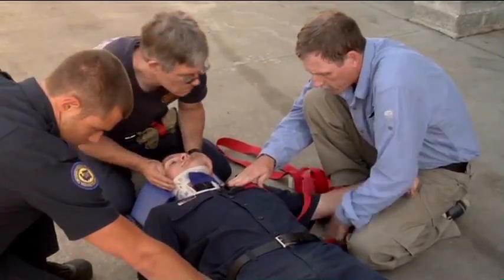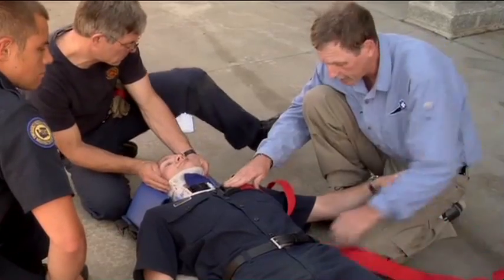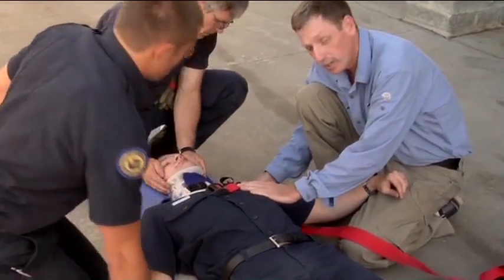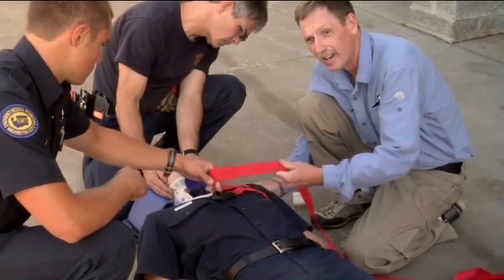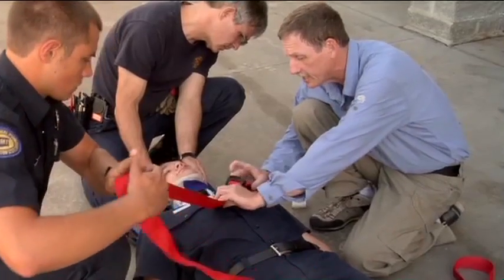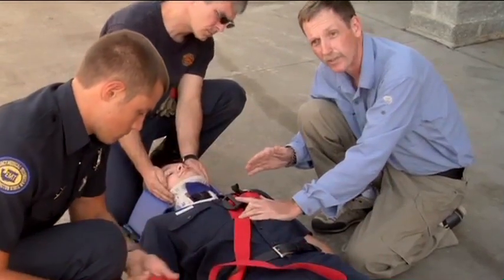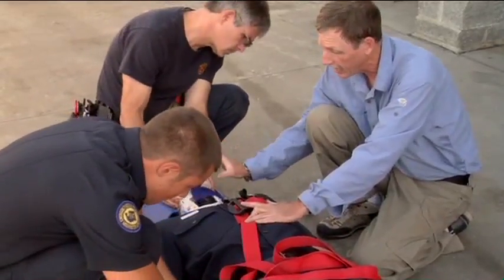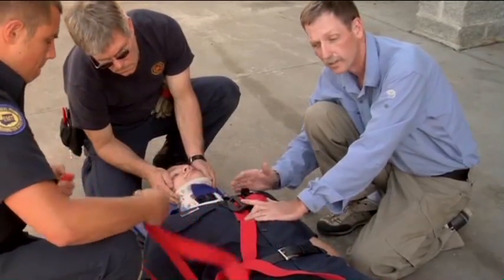Now I'm not going to knot it or create a half hitch or anything like that. It's not really necessary. What I am going to do is run the strap up over the shoulder, and that is going to create a deceleration strap at the shoulder, because at some point we're going to have this patient in an ambulance and we're going to have to be able to protect the head from the mass of the body should we have a deceleration.